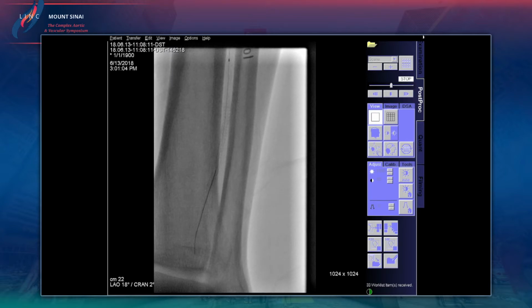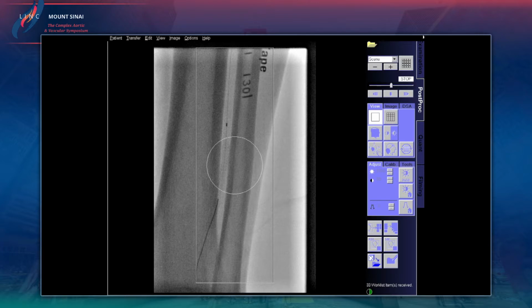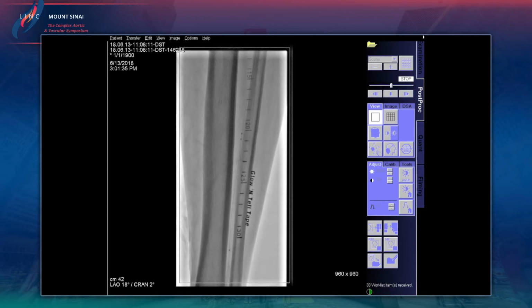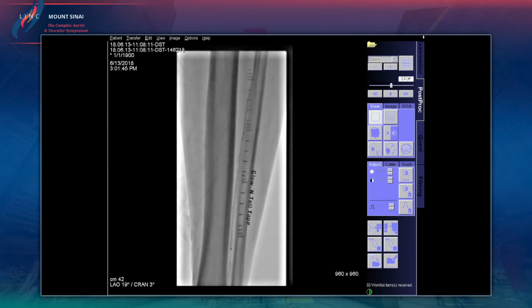I got it. Can you show me a little higher? There you go. I'm at 30 now. I'll go a little bit lower. So if we can prevent a stent in this patient, it'll be great. Well, PK, I was gonna ask you about that, but in this case, you've got a way distal DES and a proximal DES, so I think you have a pretty good idea of the size of the artery, so you probably don't need to do that. Well, it would be nice if that was known, though. That's the issue. I guess that's where IVUS would help us.